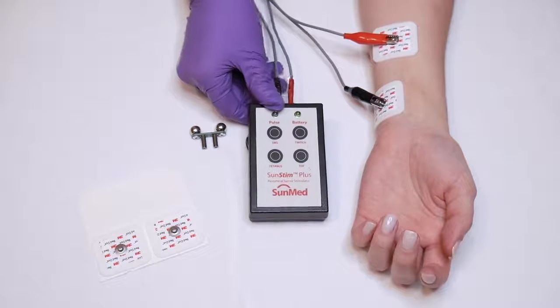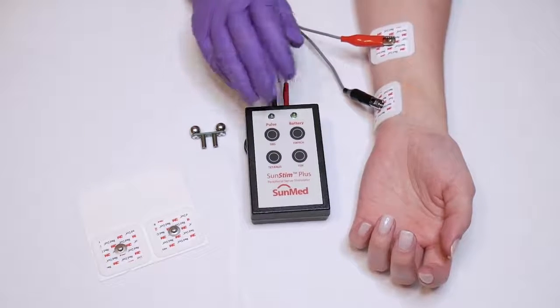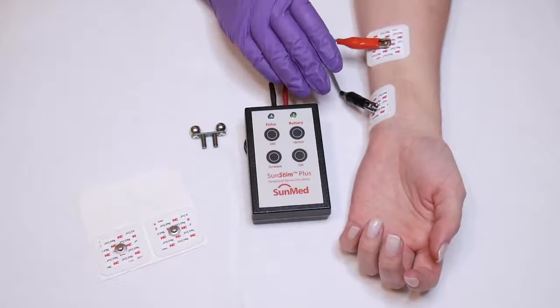When you reassess the patient after a paralytic has been administered, you should follow your hospital protocol on the number of contractions that is needed.